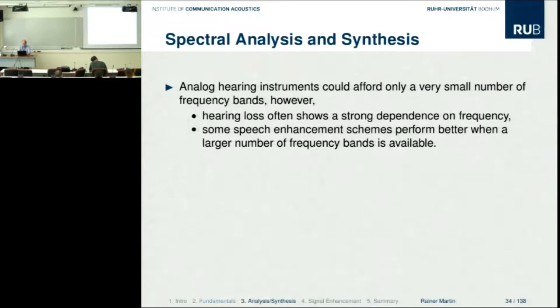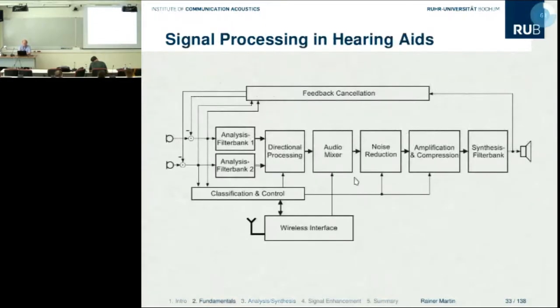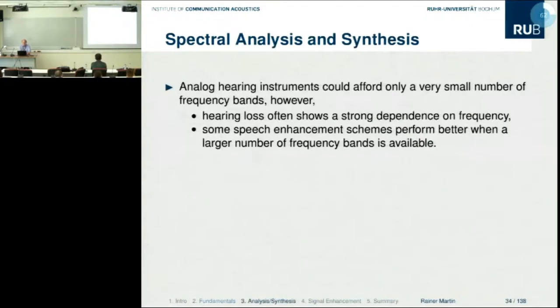So I would like to talk now about the first part here, the spectral analysis and synthesis part, and that's also related to the hands-on exercise later in the afternoon, and also related to the issue of latency, because you cannot just use the standard filter bank, but you have to optimize it for the specific purpose in terms of latency and other aspects. So in the old days, in the analog hearing instruments, you had only a very small number of frequency bands because you had to build them with operational amplifiers and discrete components and so on. There was not a lot of space to do that.